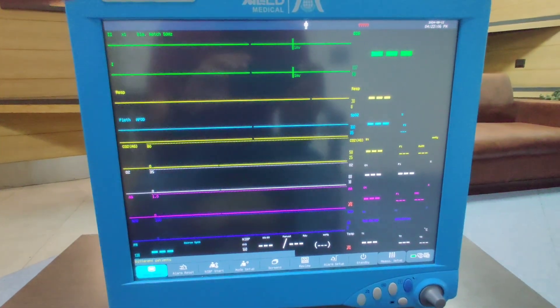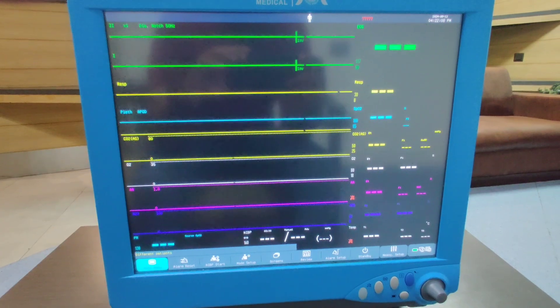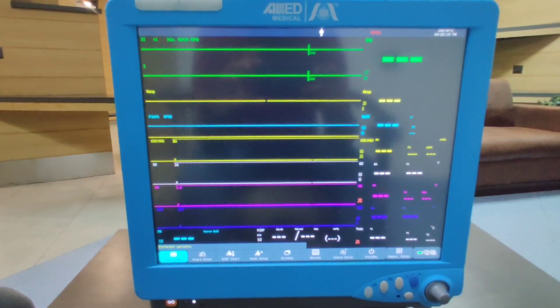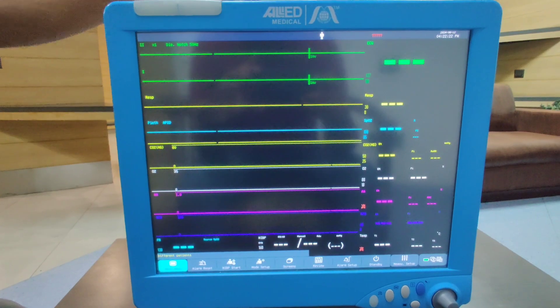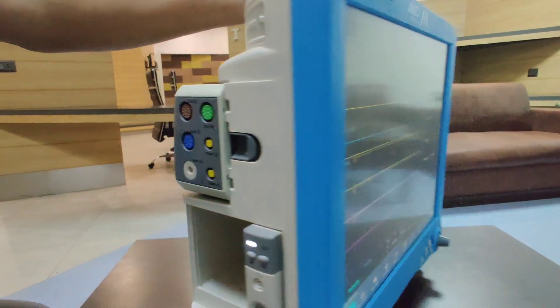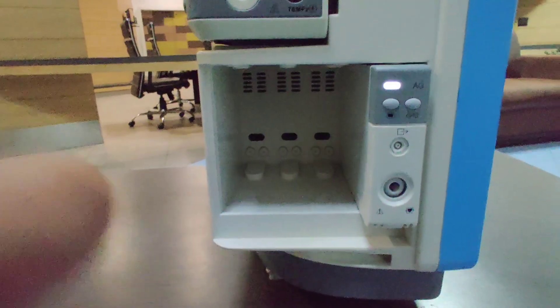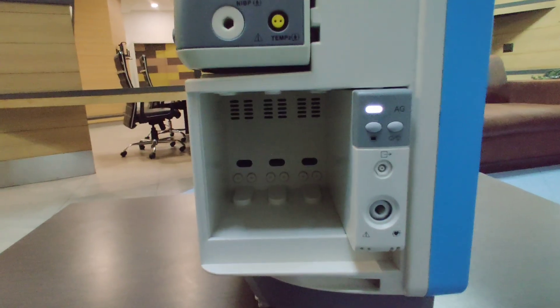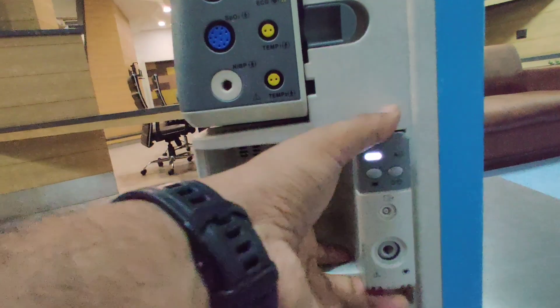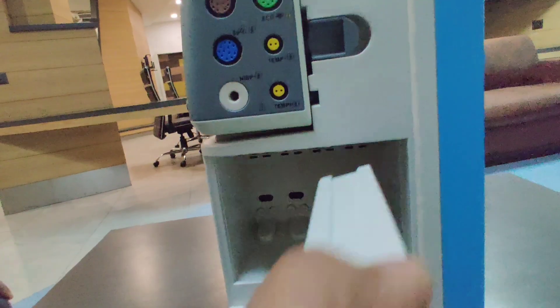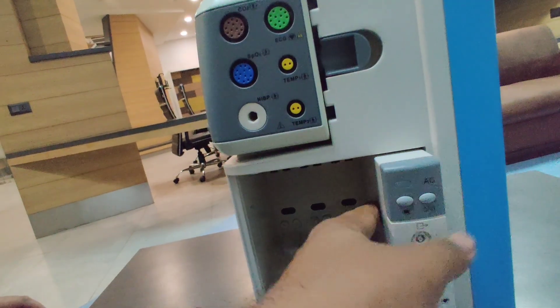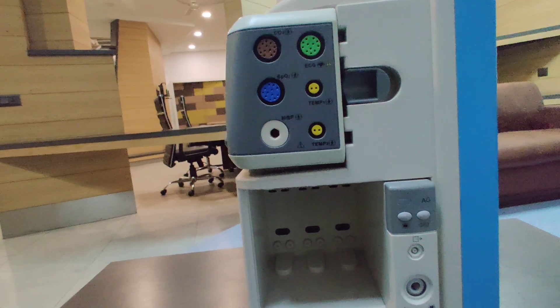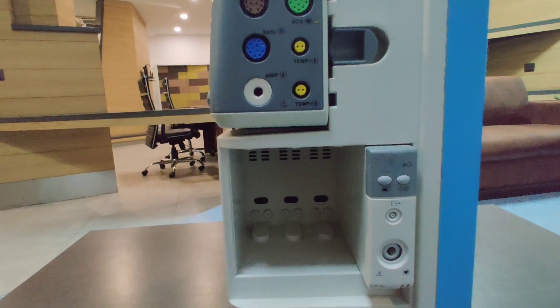Discussing the upgradable parameters, on the left side we have the place where you can mount any of the parameter modules. These are plug-and-play kind of cassettes, so as soon as you plug this on the monitor, that parameter will get activated. We have three more places for putting upgradable or advanced parameters.